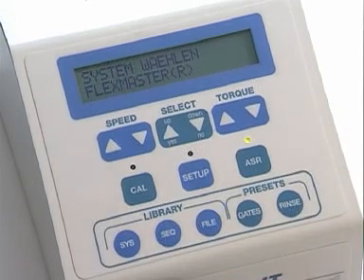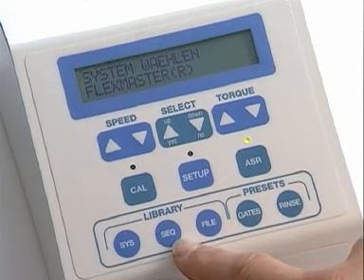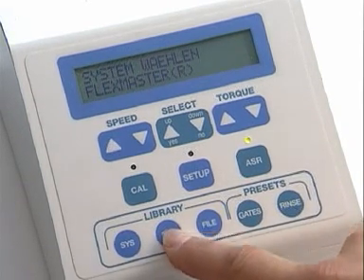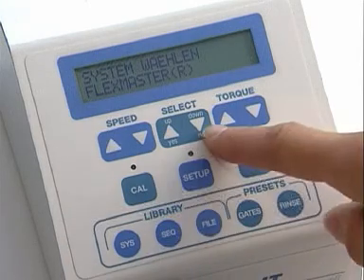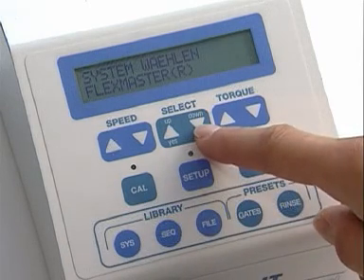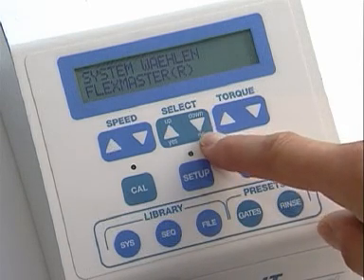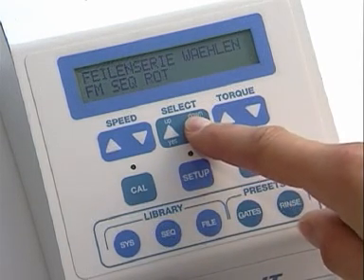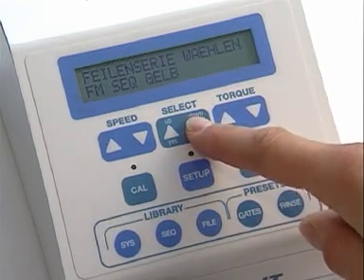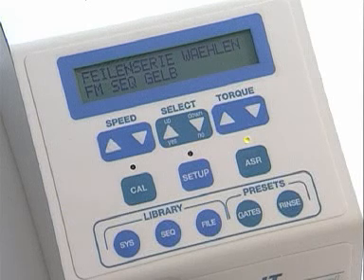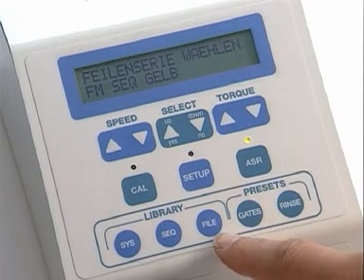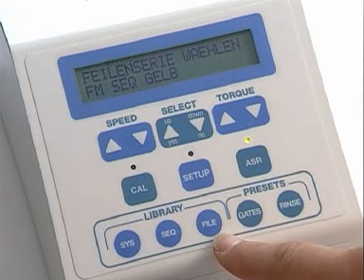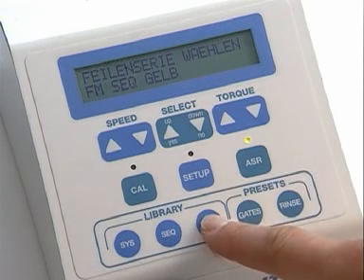The System button is for file system selection, and the Sequence button for file sequence selection according to the size and shape of the canal. The File button selects the instruments within the sequence.